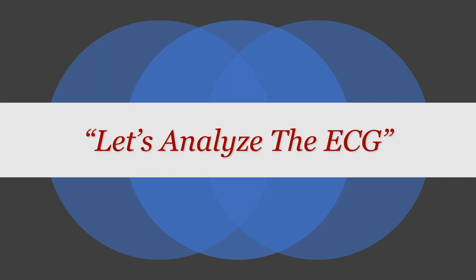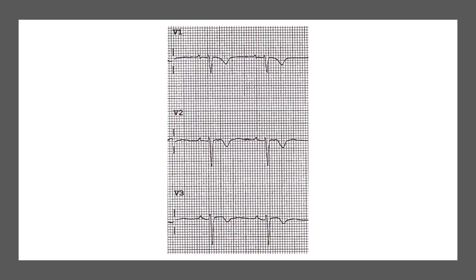Let's go back to our ECG and analyse it. Looking at V1 to V3, the first abnormality is T-wave inversion. T-wave inversion can be asymmetrical or symmetrical. Asymmetrical T-wave inversions are abnormal but can be relatively benign — associated with strain pattern or left ventricular hypertrophy. The symmetrical ones are the concerning ones, associated with PE, ACS, and other serious conditions. Looking at our ECG, the T-wave inversion here is symmetrical.